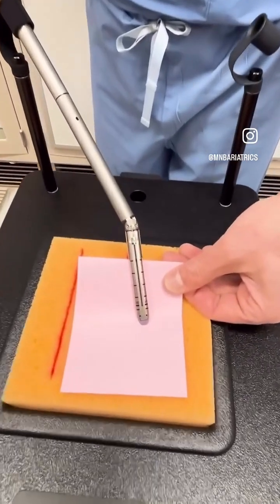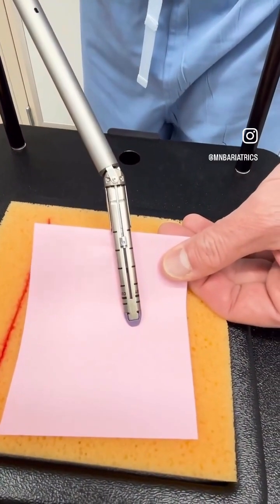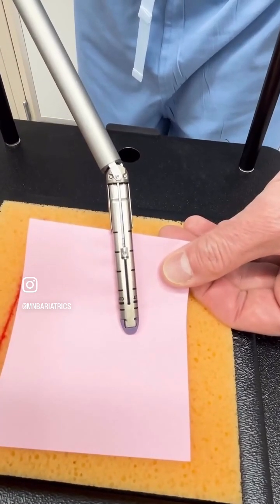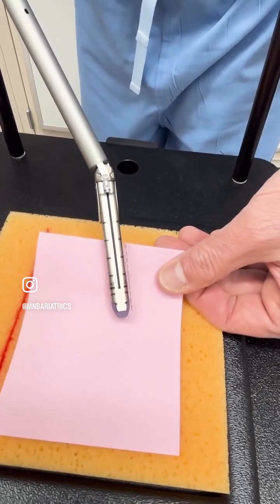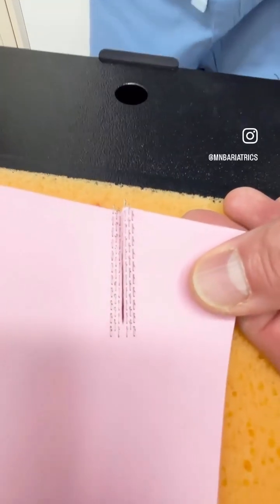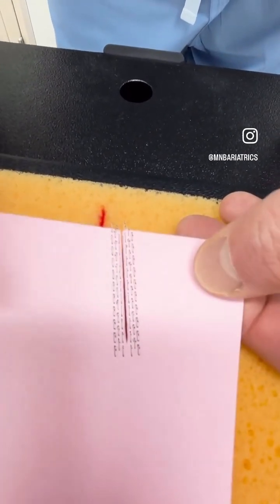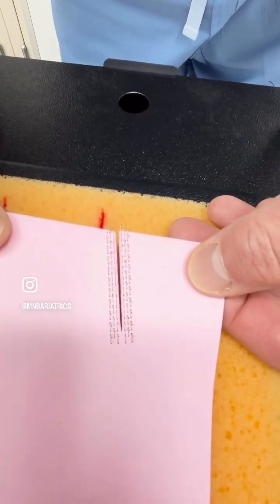And now we are ready to go. I am pressing the trigger and you can see the knife going through the tissue, all the way, now coming back up. It was fully automatic and now what we see is three rows of staples on each side, completely sealing both the stomach that stays in and the one that comes out of the body, and the knife making a clear cut in between.